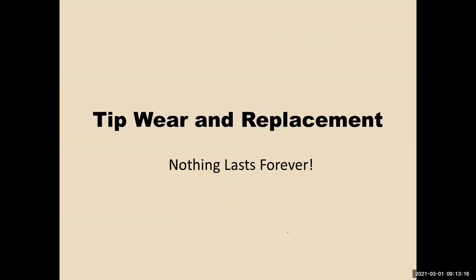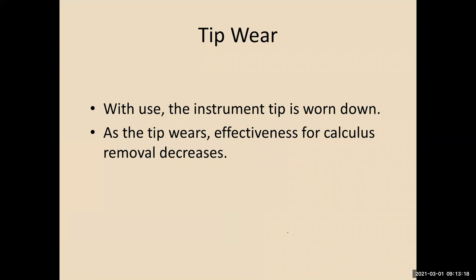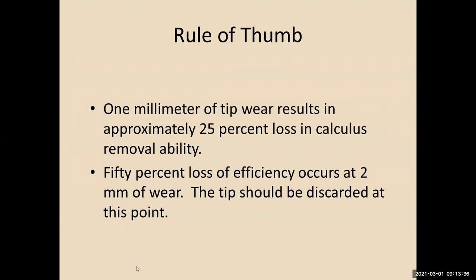Nothing lasts forever. These tips do wear. That's why we don't allow you to purchase ultrasonic inserts from previous students. Well, I only use them in school. Well, they're still not new. Instrument tips are worn down. As the tip wears, the effectiveness for calculus removal decreases. So 1 millimeter of tip wear results in approximately 25% loss in calculus removal ability. 50% loss occurs when 2 millimeters is worn down.